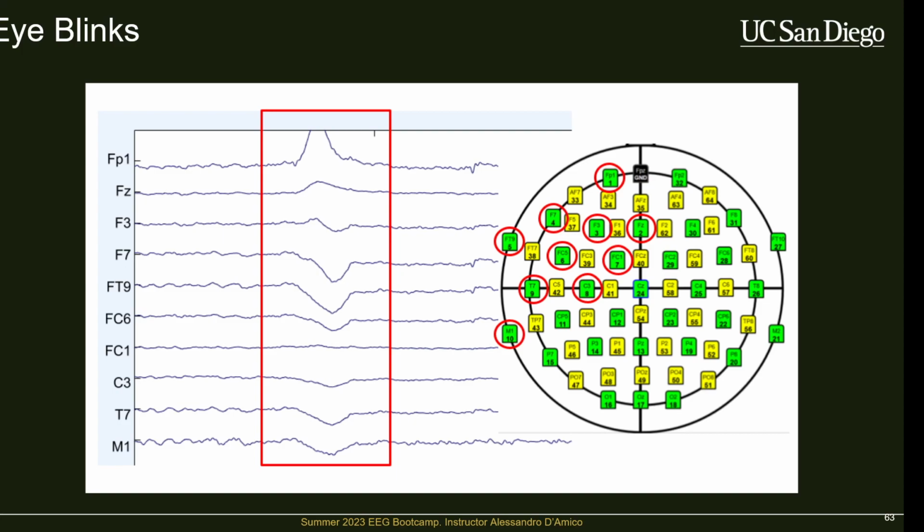Obviously, you can imagine that seeing a picture of a mutilated corpse just flash in front of you might be a little bit startling. So you might blink, you might jerk, you might tense up your muscles somehow. And those artifacts, in this case, are systematically tied to only one of the conditions, right? Because when you're seeing the teddy bear, you're just calm, you're taking it, then you see a mutilated corpse, and that's going to be quite a lot.